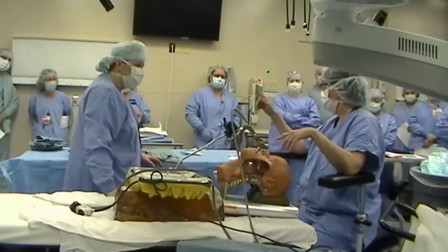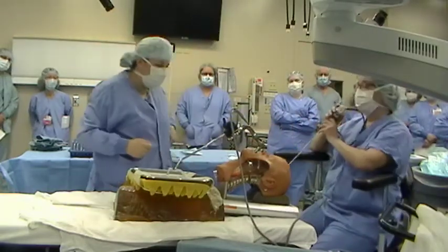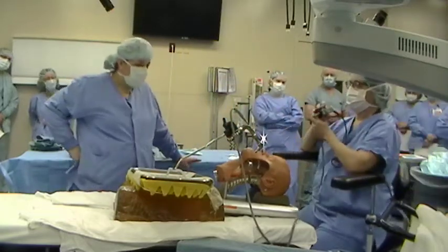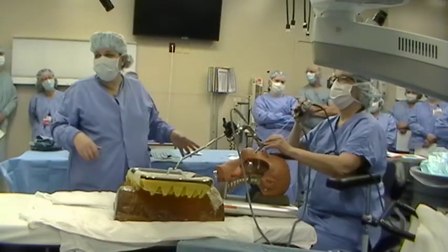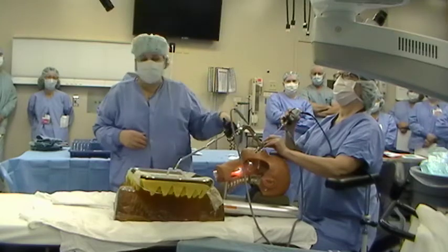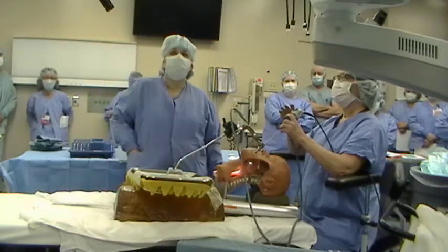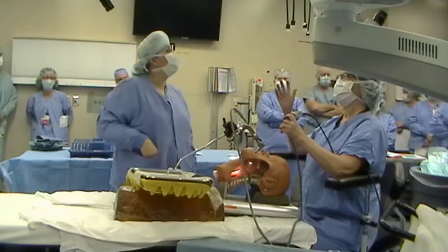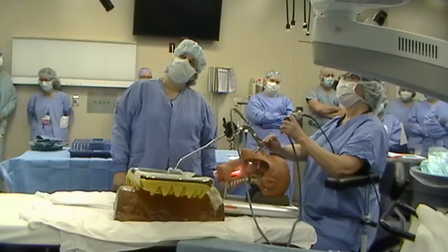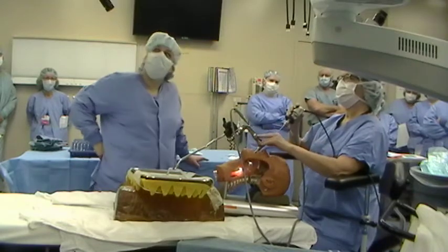Once this is in, let's use the telescope. Usually Fred is on the shoulder right here so that I can dab it and get my lens clean. I always have a five-in-one tubing connected to the suction because it makes it flexible — the other is too rigid and tends to flop directly in front of where she's trying to look. So I take pictures beforehand. It's important to document where the cancer, nodule, cyst, or whatever it is. I need white balance before I take pictures.